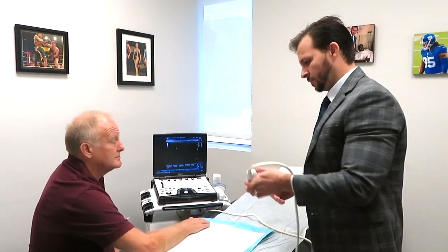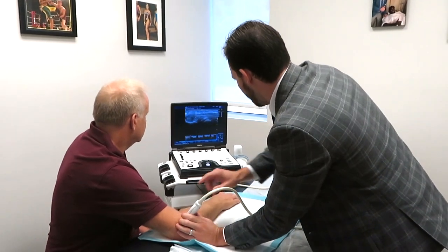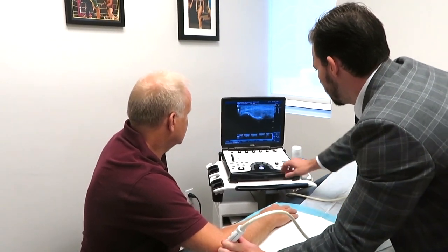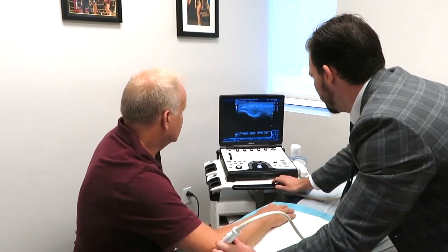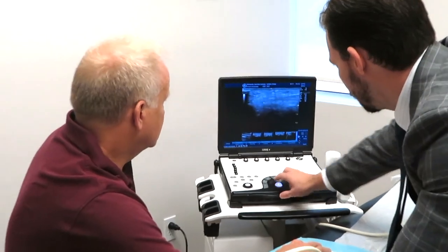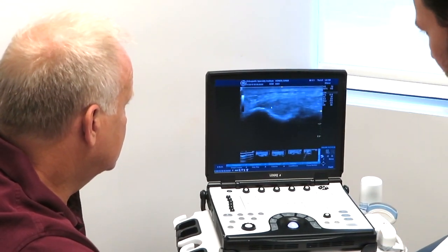So with ultrasound, right now we're going to see the common extensor tendons. The patient's been having lateral elbow pain for quite some time, especially after doing a lot of wrist flexion and extensions. With ultrasound, we were actually able to trace down the tendons all the way to the attachment of the lateral epicondyle.